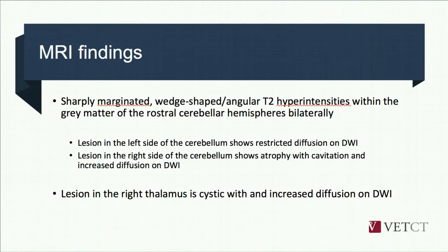In summary, the MRI shows sharply marginated, roughly wedge-shaped or angular T2 hyperintensities within the grey matter of the rostral cerebellar hemispheres bilaterally, and a lesion in the right thalamus. The left cerebellar lesion shows restricted diffusion on DWI, while the right cerebellar lesion shows atrophy with cavitation and increased diffusion on DWI. Additionally, the right thalamic lesion is cystic and also shows increased diffusion on DWI.